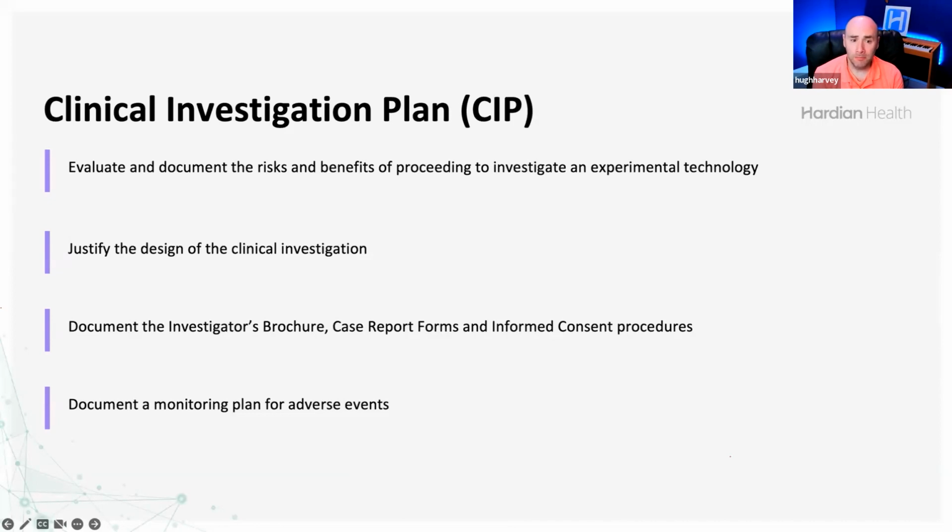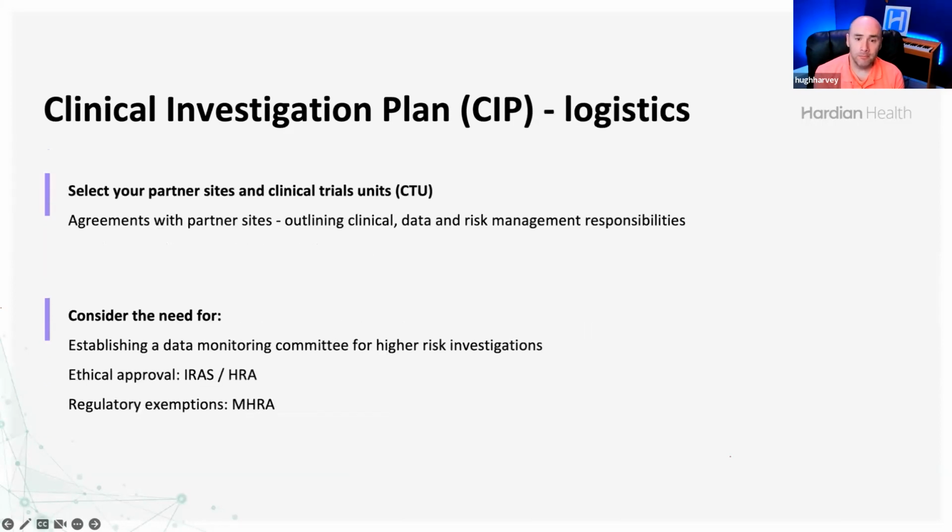So moving on. Oh yeah, I should also mention that you can have multiple CIPs. So if your device is making multiple claims and it's not practical or possible to measure them in one clinical investigation, you can run parallel or multiple clinical investigations. So you can have multiple CIPs.